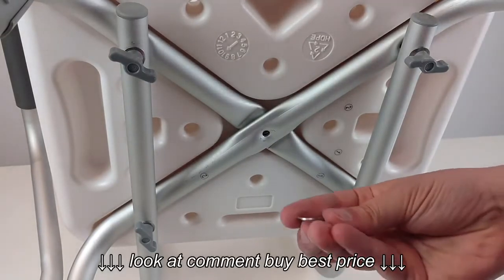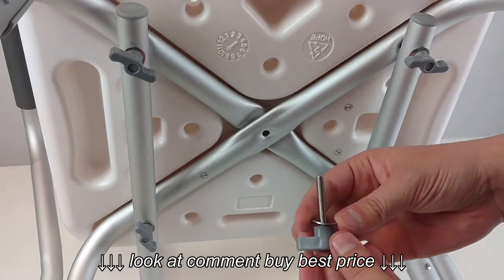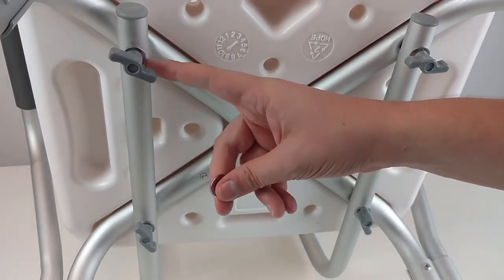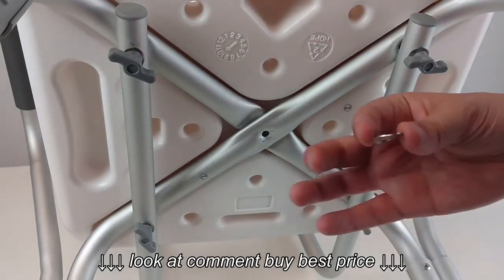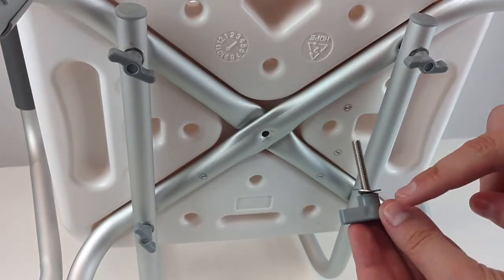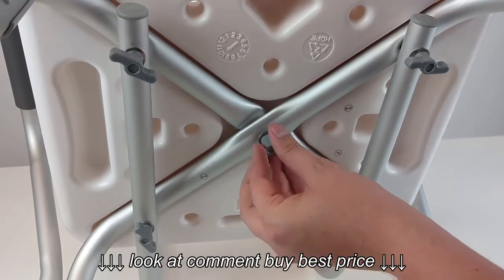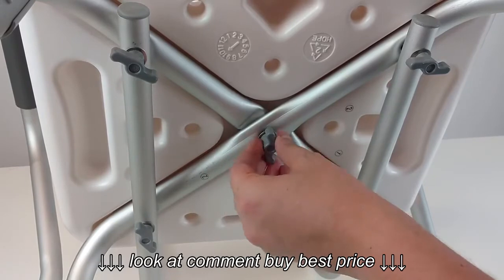Take the washer and the hand screw and put them together. Normally you can tell by the way the washer's curved which way it should fit onto the tubing. These, up here for the long screws, will fit with the curve of the washer curved away from the plastic head and curved toward the metal tip of the screw. Put that in, go a few turns, and it'll be in place.